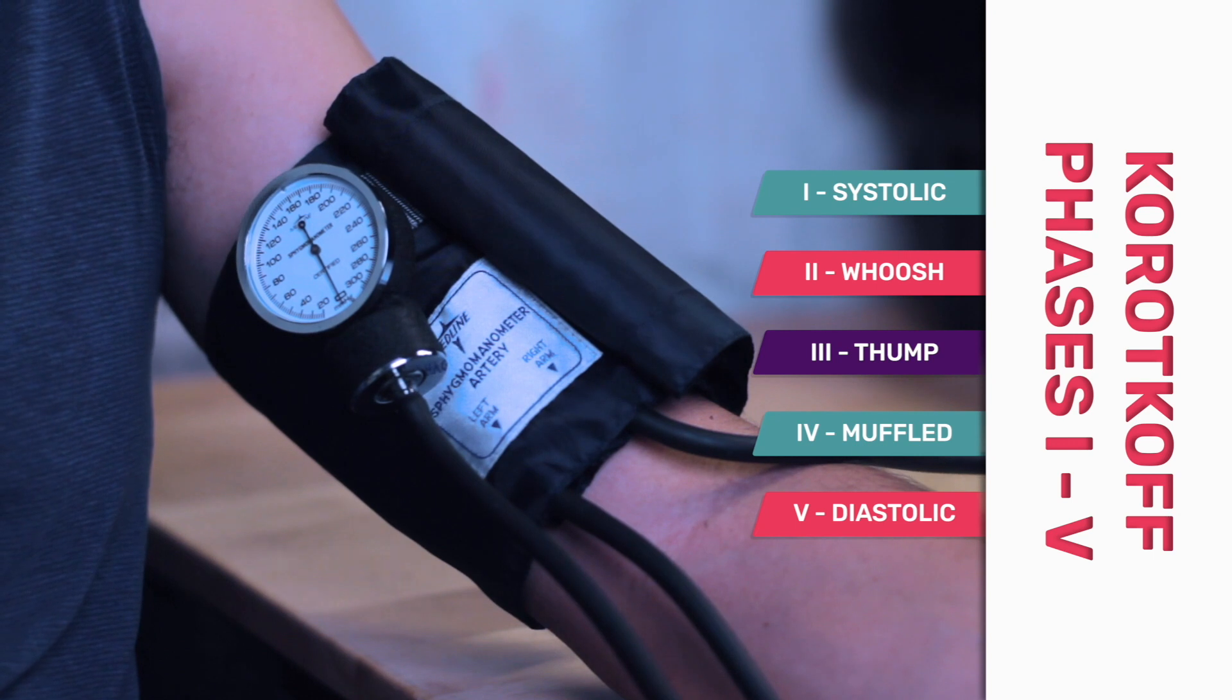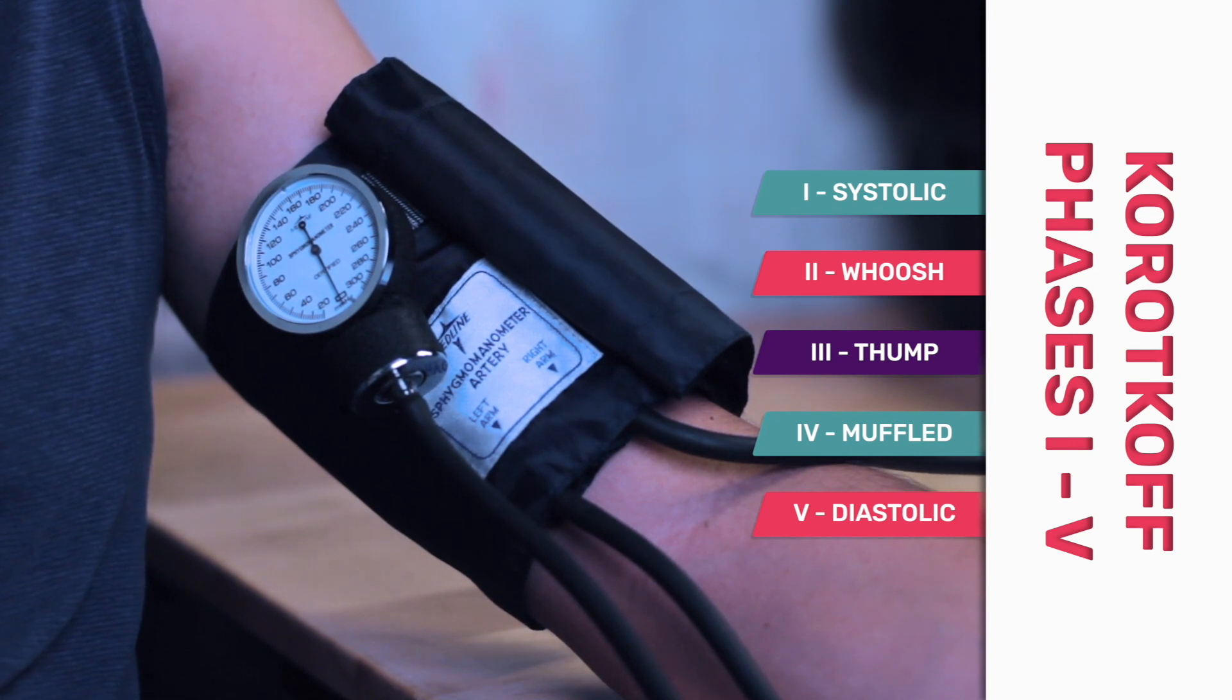So phase one is that sharp tapping sound, which is your systolic sound. So that's that first sound that you hear.